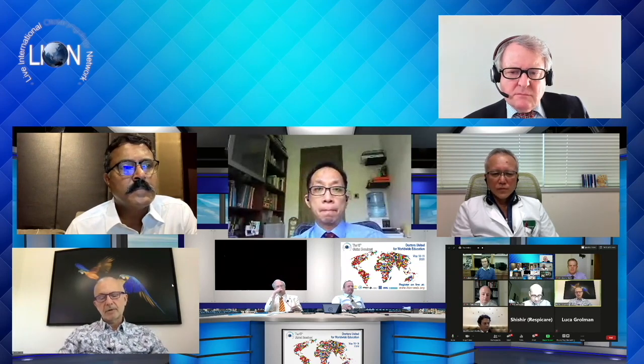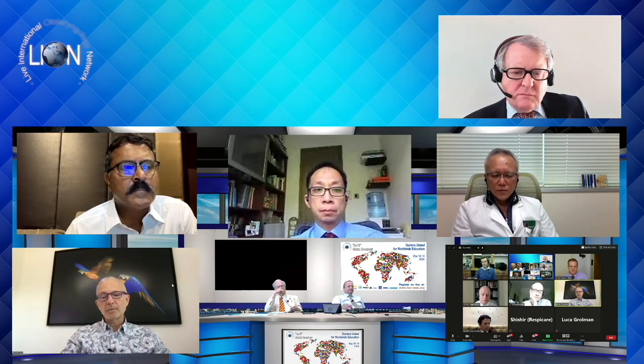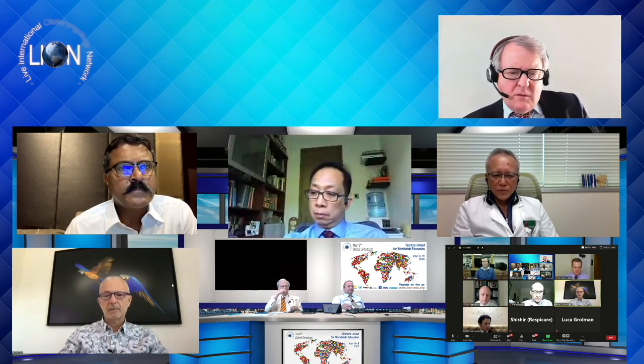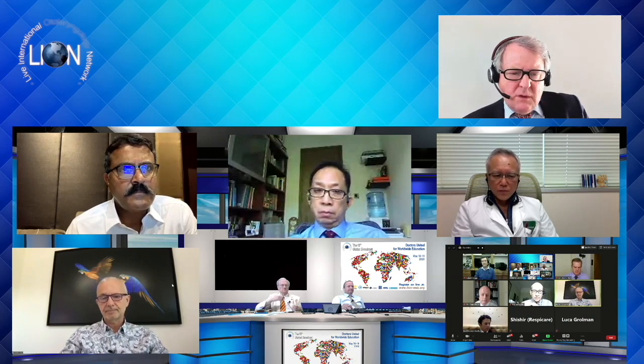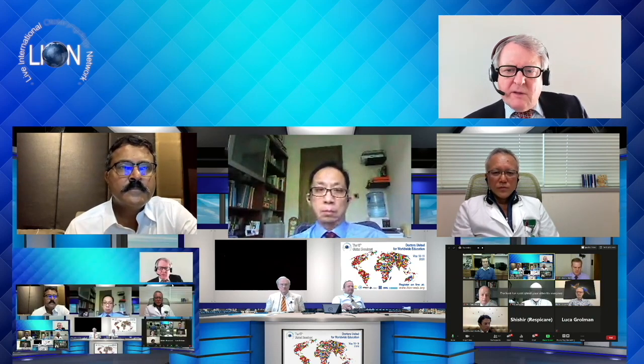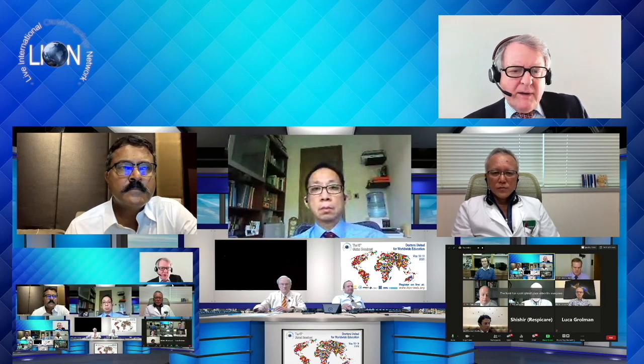That's important not to overexpose, of course, the incus, otherwise there's a risk of retraction of the tympanic membrane. So I would say just keep moving until you can see the fissure. That's enough. And it usually is something like only one third of the distal tip of the incus in the majority of cases. Okay, so after that, you moved on to actually performing the dissection proper.